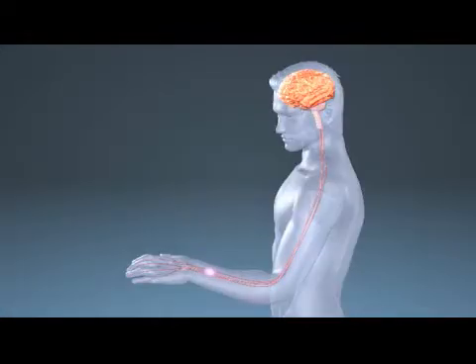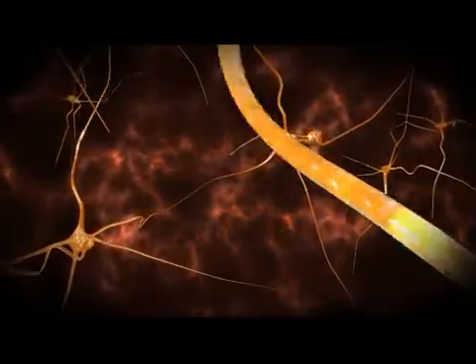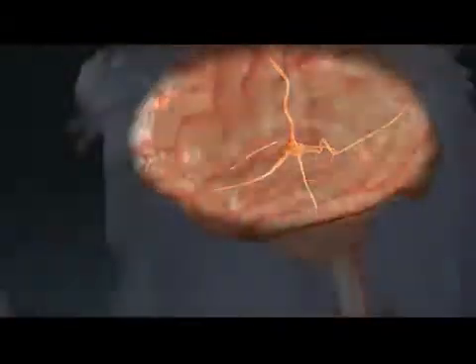The patient's neuromuscular system has the amazing ability to repair itself following the right intensive and repetitive therapy. This has been shown to lead to a significant improvement in hand function.